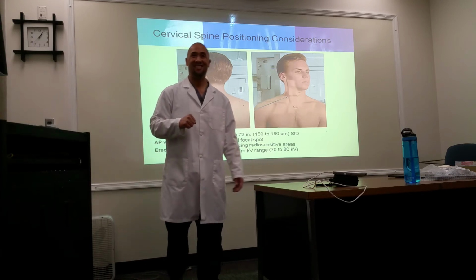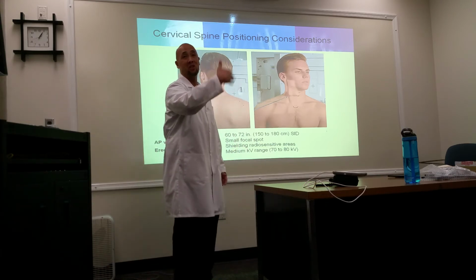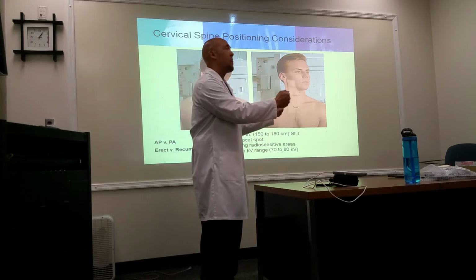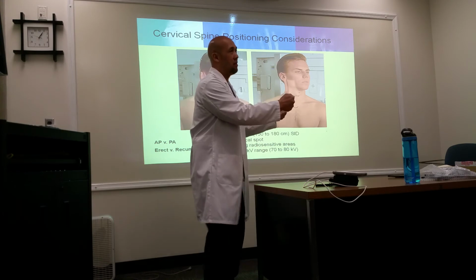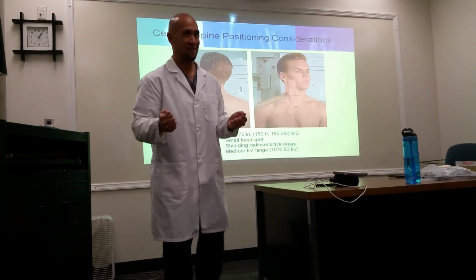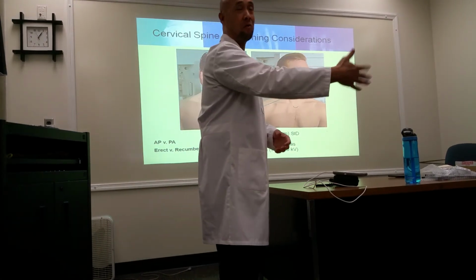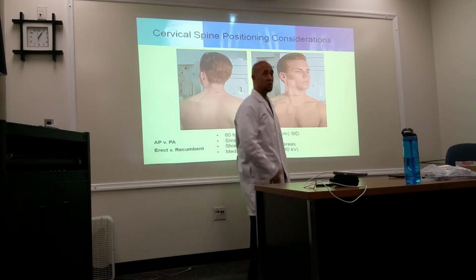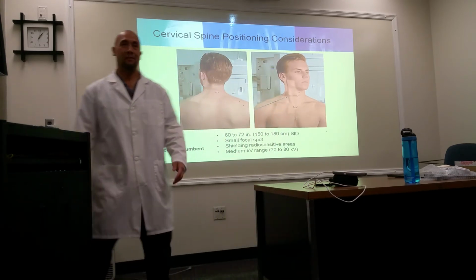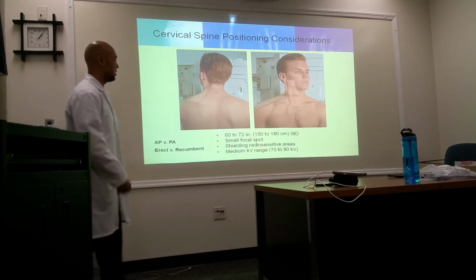But what you will also see in practice is that once they keep it at a certain distance, they leave it at that distance. So they can start off at 40. It's too much of a pain to go from here to here. That's a lot of work. So you will see a lot of techs just starting off at 72 and doing it at that distance, doing their AP obliques and their laterals and their open mouth. So it's more of practicality than theory why they do it that way.